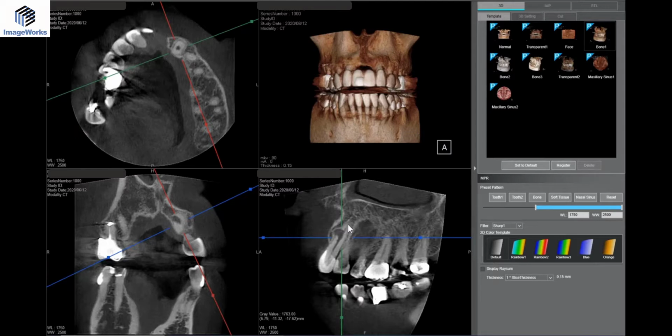So I said, let's be safe. I'm going to send this over to my colleague, an endodontist who also has the laser, and see what he can do. He couldn't do the very end either. He just sealed up to here and cleaned this out as best he could. He said if anything else happens, we'll have to go back in and do some surgery. So far we're watching it. It's asymptomatic, and if it stays quiet, that's great. But this sure allowed us to get a much better look at what was going on with this tooth.